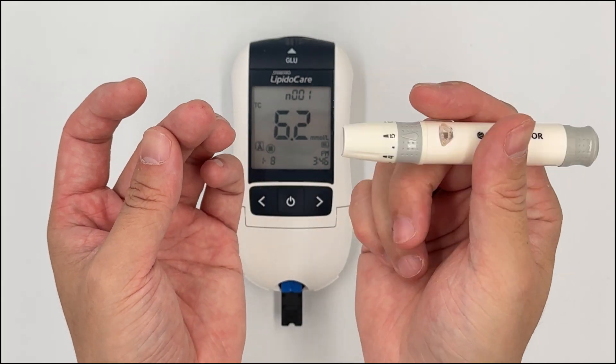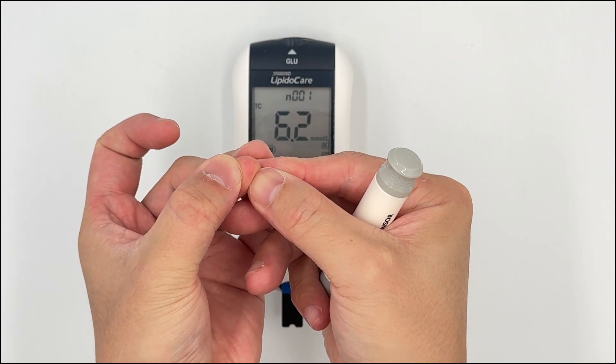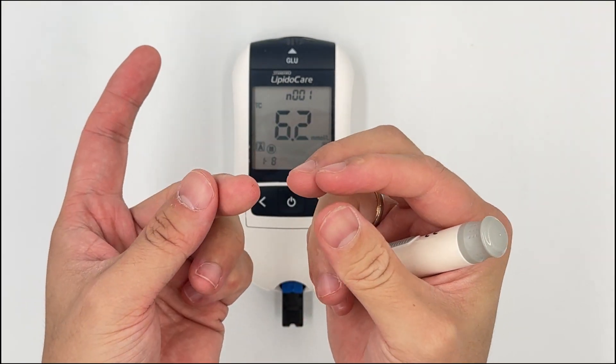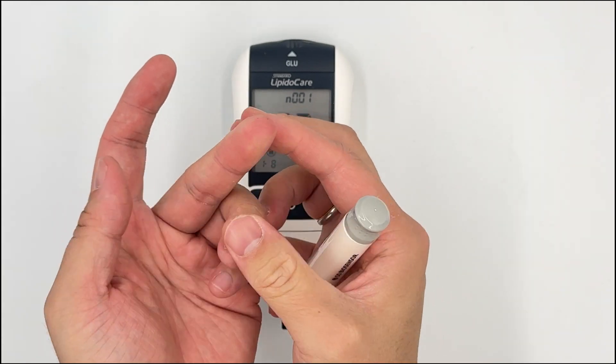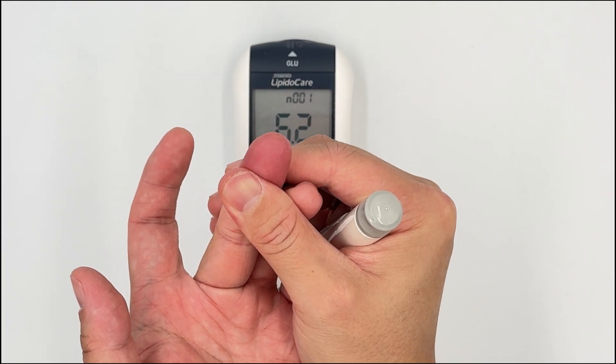Tip number five: after pricking the finger, do not squeeze the finger to get the blood. When you squeeze like that, plasma gets mixed with the blood you want to collect, affecting accuracy. Instead, always massage the finger to bring out the blood — this gives you the best accuracy.